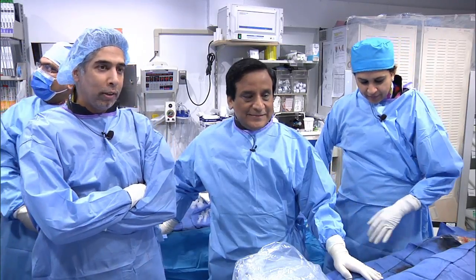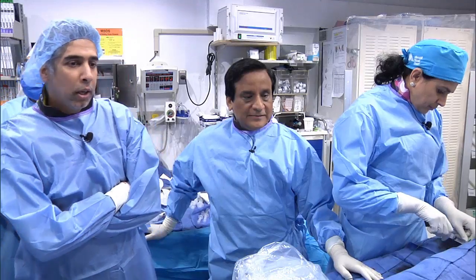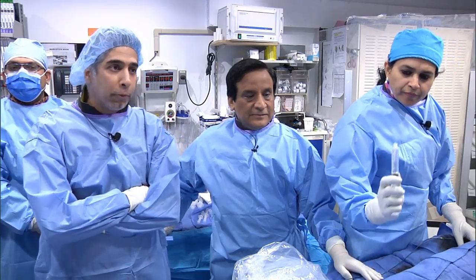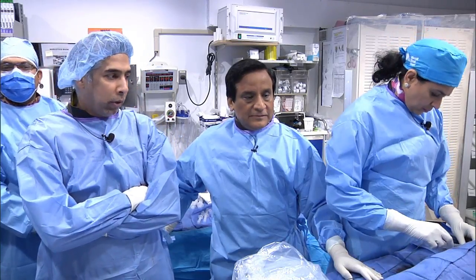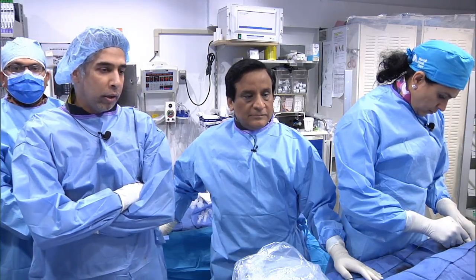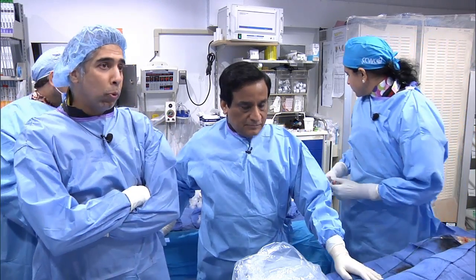Right. Thank you. This is part of a larger bleeding avoidance strategy. As we know, the relationship between bleeding and significant clinical outcomes has become more and more clear over the last several years. I'd like to stress that it's really a radial first strategy, which is a buzzword out there, to understand that it should be considered in all patients, but there are a lot of different variables that would dictate whether or not we would move forward.